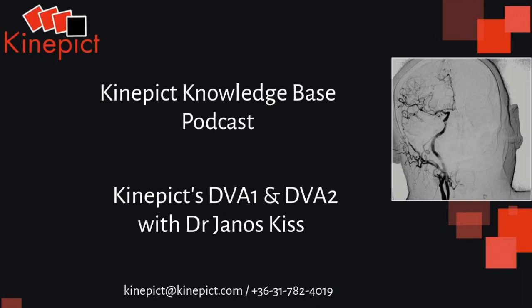I wouldn't go into the mathematical details. The most important thing is that the DVA2 reprocesses the images. Okay, and what are the big mathematical and algorithmic differences between the DVA1 and DVA2? Well, I wouldn't like to go into the fine details, but the main difference is that DVA1 is based on the standard deviation calculation.